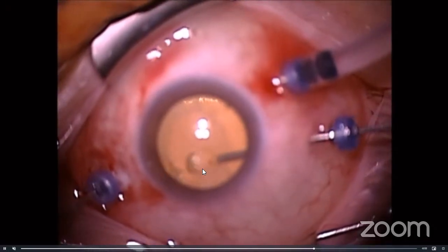From here, you can see that the retina is slowly unfolded and flattened. With the aid of this heavy liquid, you can peel the PVR membrane if there's any. In this case there was none, so there was laser to seal off along the posterior border of the giant retinal tear. And he did a 360-degree laser to prevent any redetachment or slippage later on.